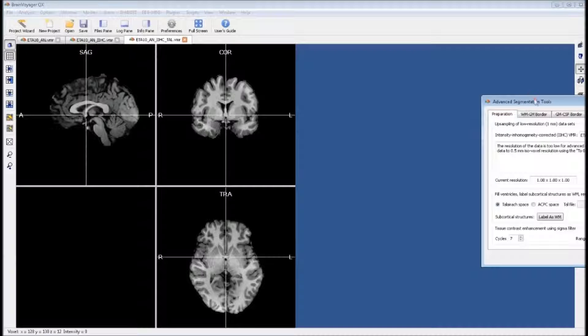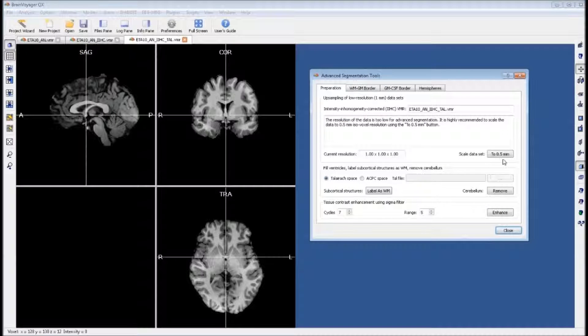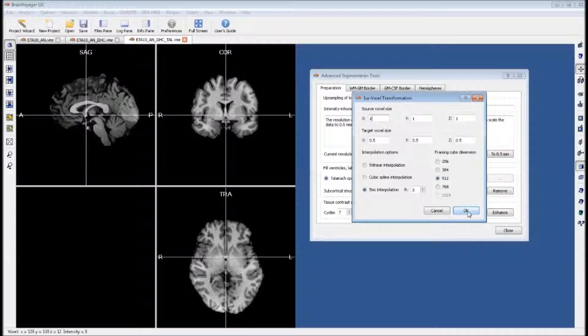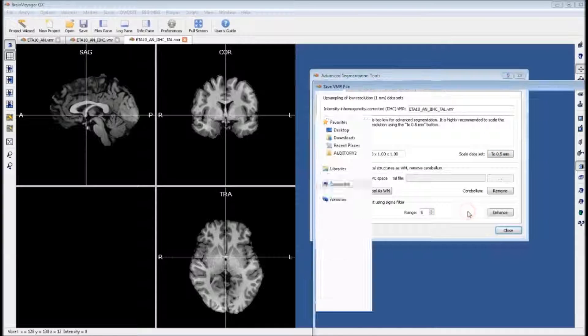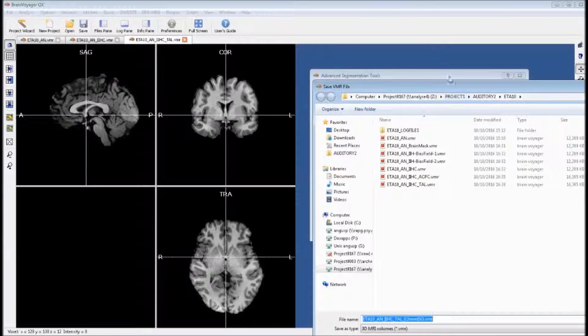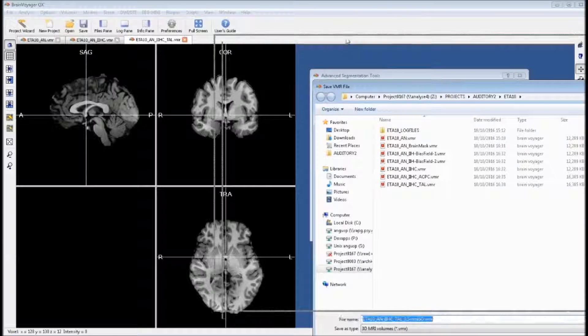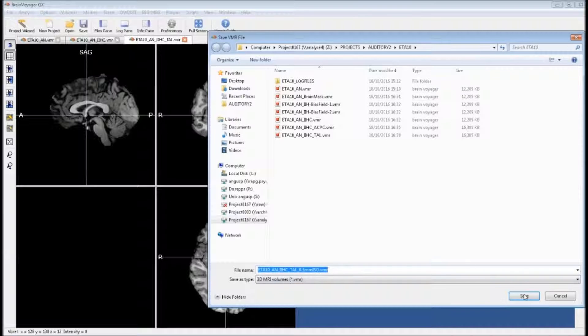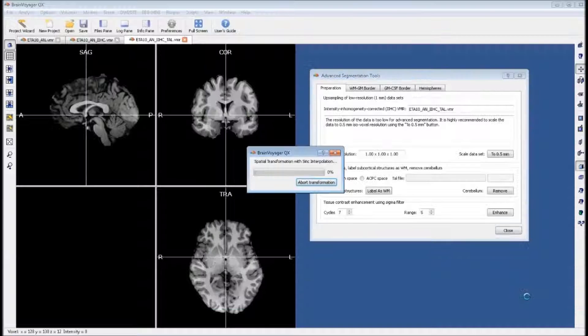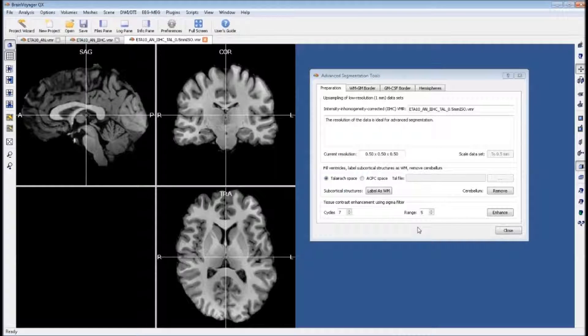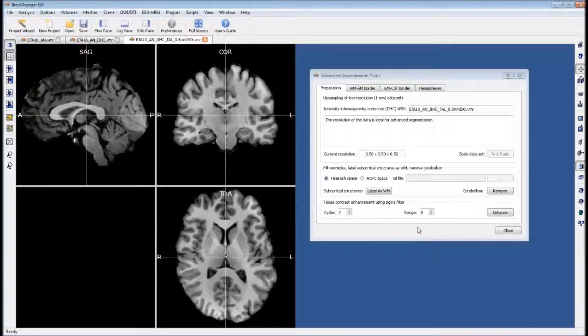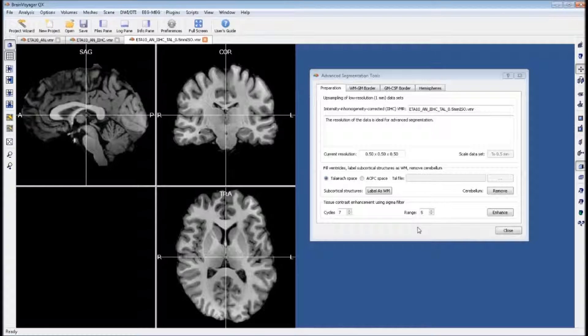Click on volumes, advanced segmentation tools. We want to upscale this VMR to 0.5 millimeter resolution. This will prompt a window to open up where we can save this new file, and what you get is this larger looking brain.